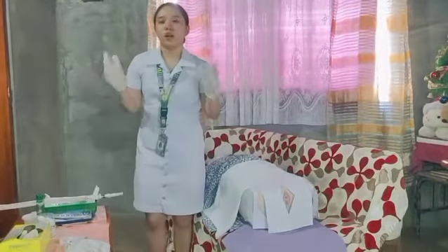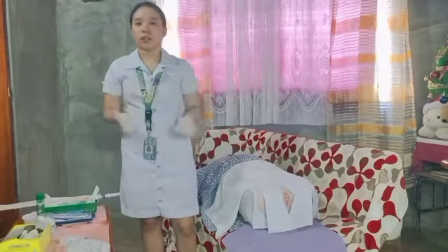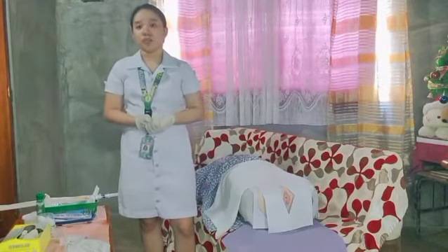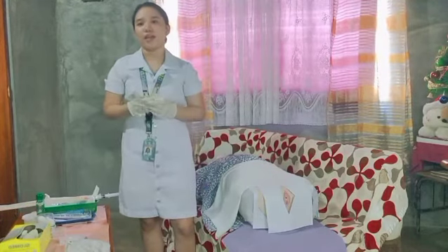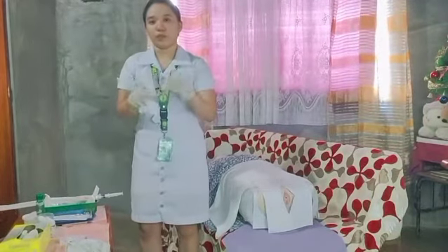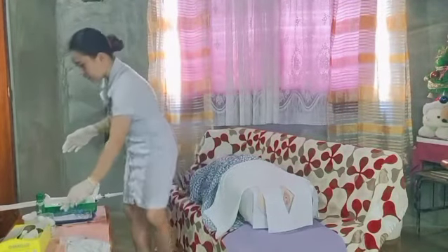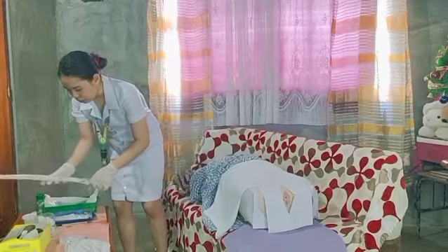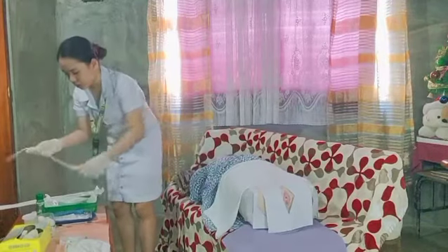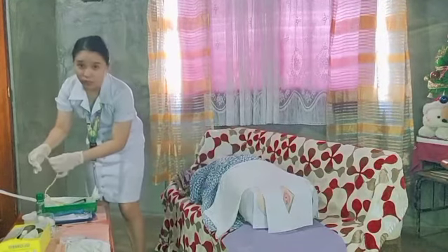So, also, add lubricant, placing it on the top of the glove of the dominant hand, and lubricate 1 to 2 inches of the catheter tip. The rationale, lubrication minimizes urethral trauma and discomfort during the procedure. So, this is our lubrication. Lalagyan natin dito. And then, i-lubricate po natin itong ayan. So, i-lubricate natin siya.